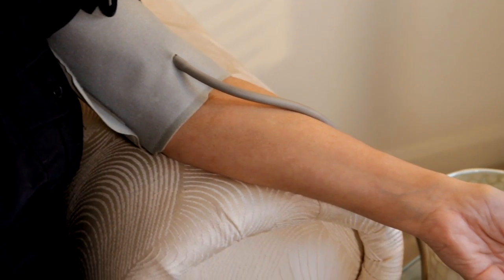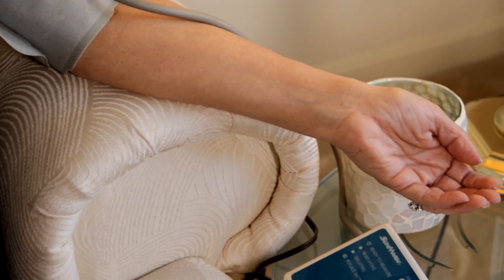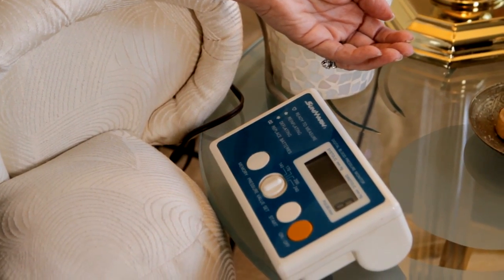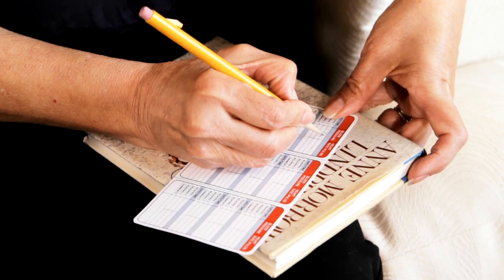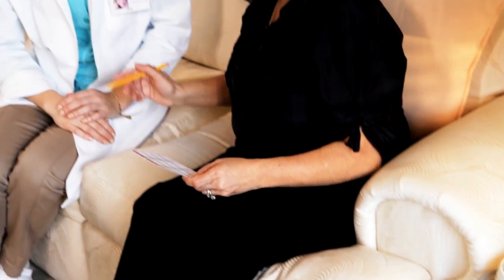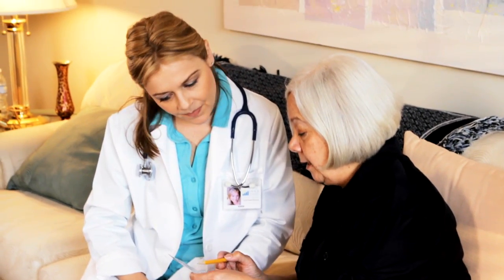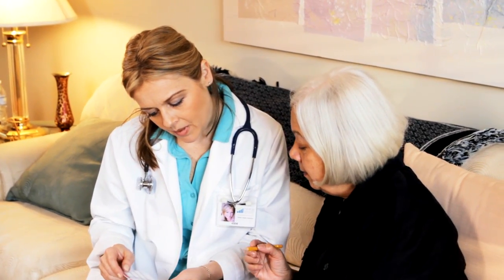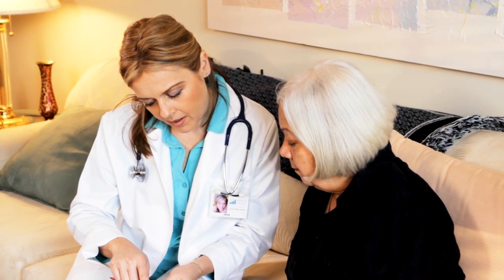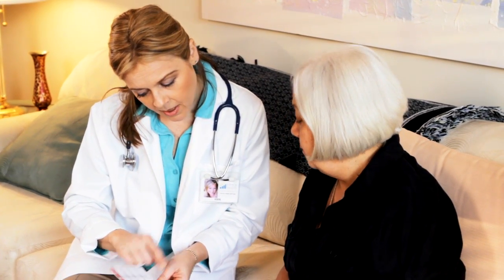Go ahead and start your monitor. You'll want to take two or three different readings from the same arm with about one minute in between each reading. Write down each of the readings and you will average them together. If you're not sure or uncomfortable with averaging them, write them all down in your blood pressure log, a tracking sheet, or a calendar. Your healthcare provider will get the information they need.